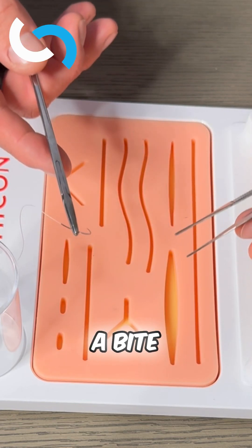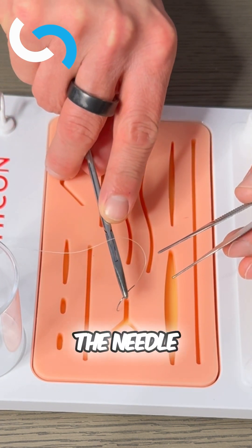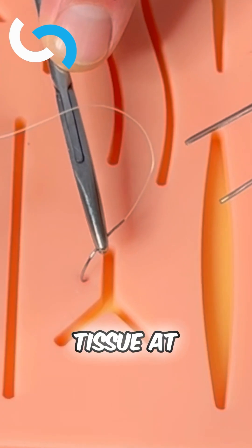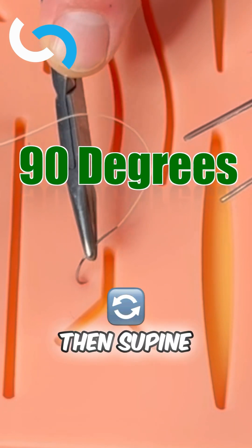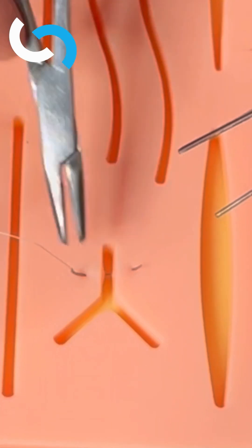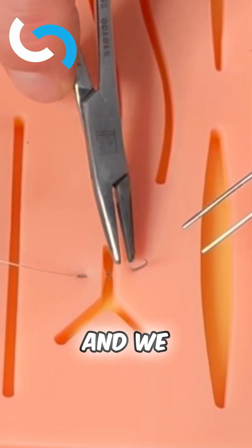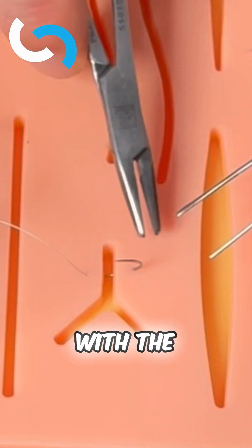The correct way to take a bite of tissue is to pronate the wrist so that we get the needle into the tissue at 90 degrees. We then supinate our wrist, using the curve of the needle to take a bite, drive it through, and pull that out with the needle driver.